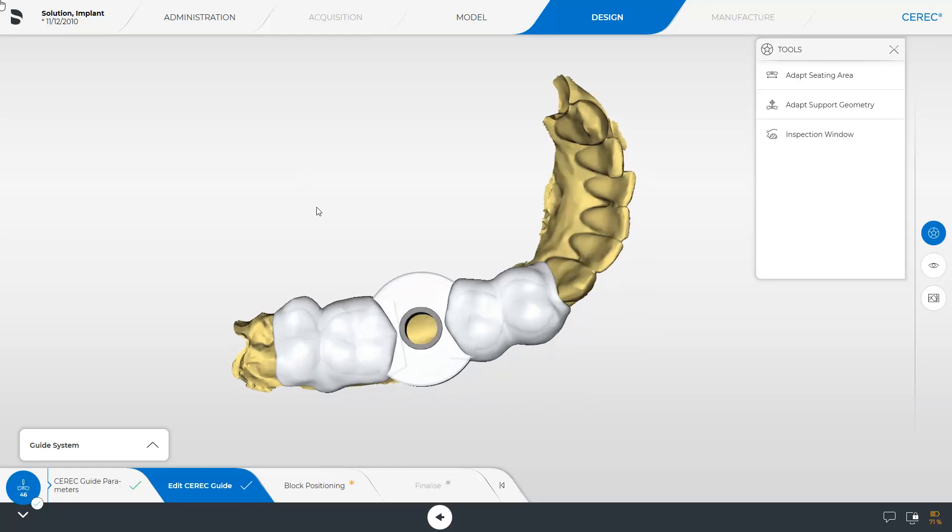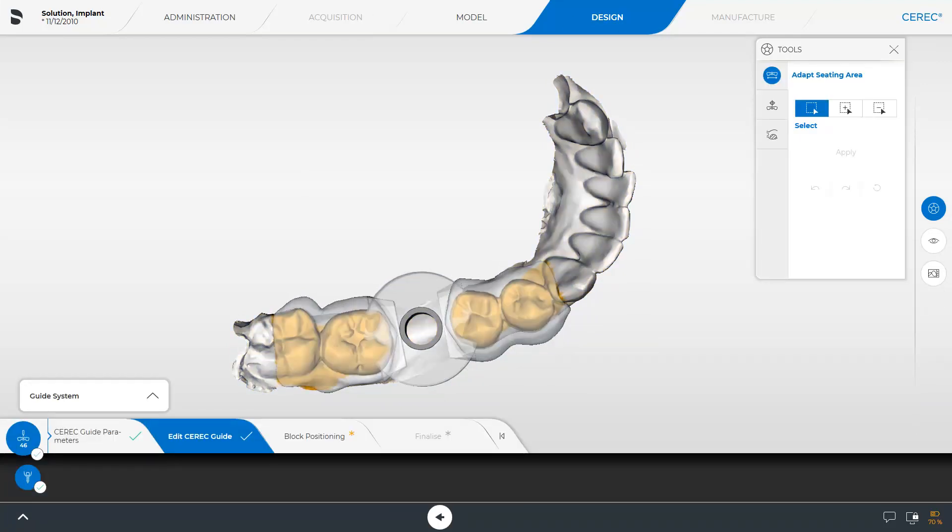We begin with the Adapt Seating Area tool, where three options are available. The option Select allows you to mark complete areas and lengthen or shorten the surgical guide seating area. For demonstration purposes, we extend in mesial direction.